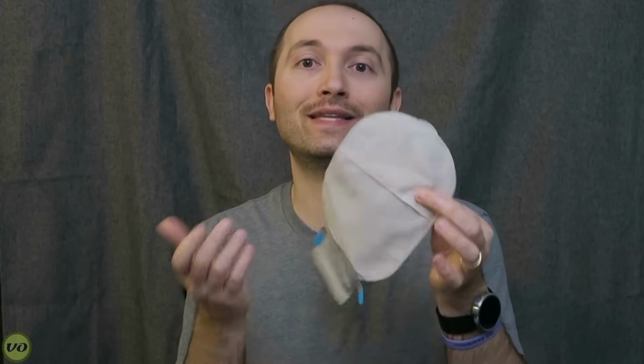Especially when you're talking about a system like the Coloplast Sensura Mio, which happens to have a very flexible wafer. It honestly feels extremely comfortable. There's no plastic there that you got to worry about. Obviously, there's no flange there. So that's an option for someone who really wants to go after comfort. But having said that, as we get on to the two-piece systems, I'll explain something that gets you kind of the best of both worlds.